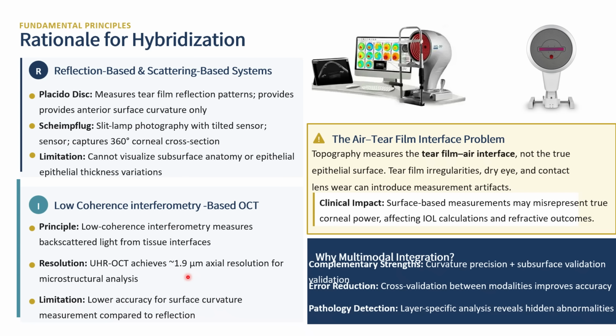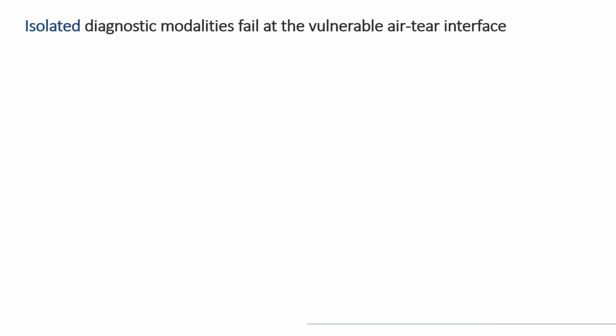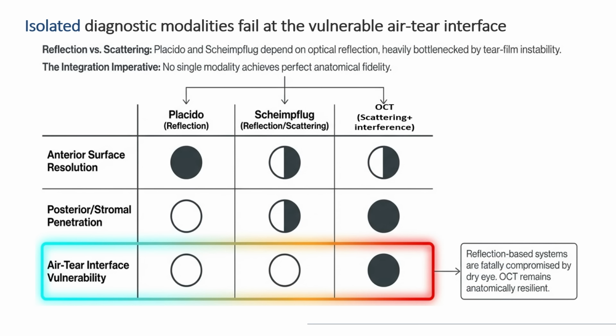So we will see very good details for the cornea. Each lamella and each layer of the cornea can be seen with very high resolution. So this is the future for corneal imaging, the use of this combination so that we can have a synergistic effect. Synergistic effect means that not 1 + 1 = 2, but 1 + 1 is more than 2.